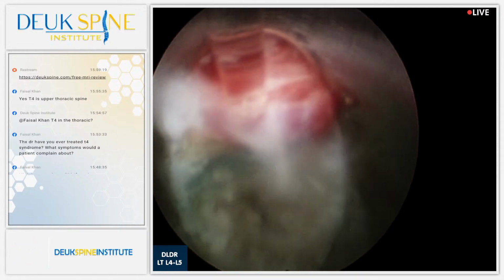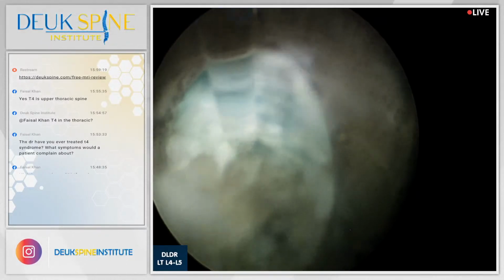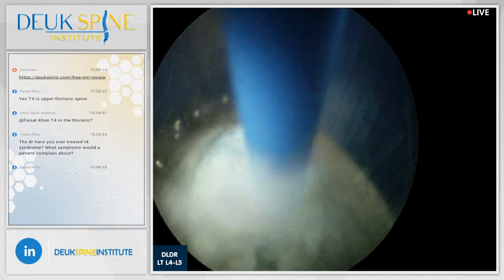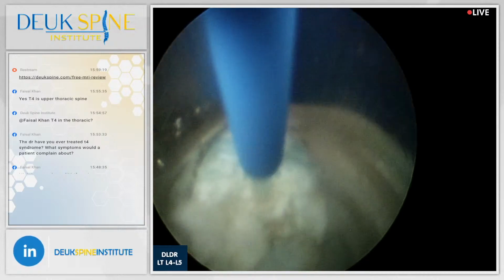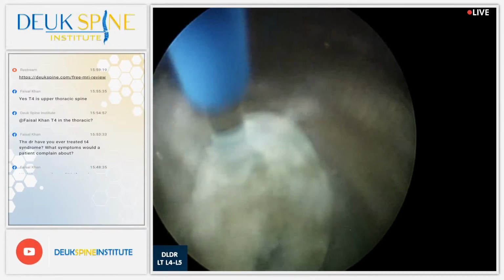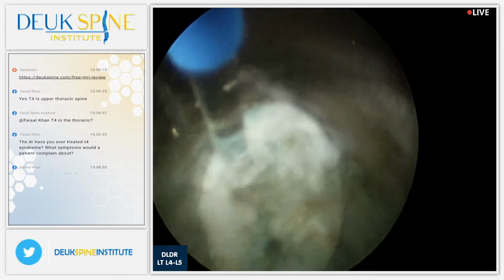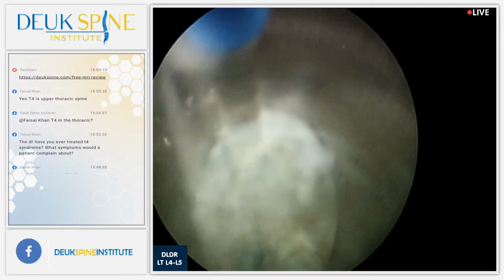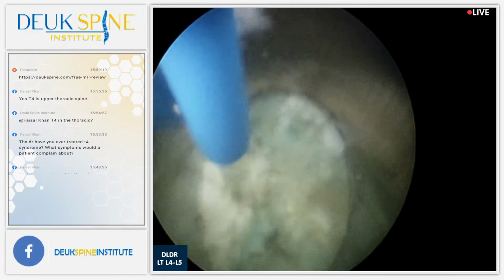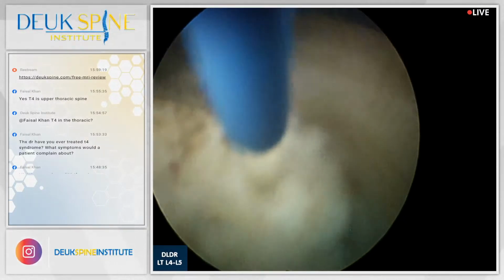Do you know why this vein is so big? The answer is because the disc herniation has only been for a short time. You see, chronic large disc herniation, they cause so much inflammation around the disc that the veins will scar down and become small. You won't see them. So most of our patients, we never see the veins. Okay? We see it on this one because this herniation is new. It's not old. It's new. So the amount of scarring of the vein has not happened. Okay? That's why we see it. That's a normal looking vein. It's called Batson's plexus.